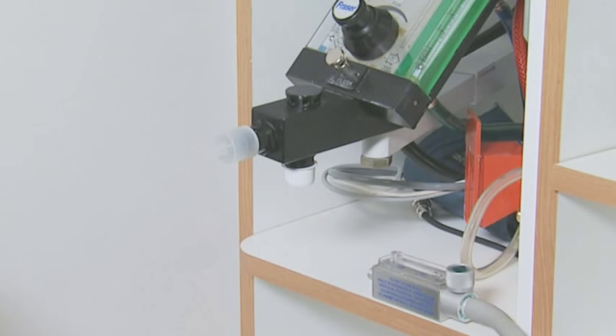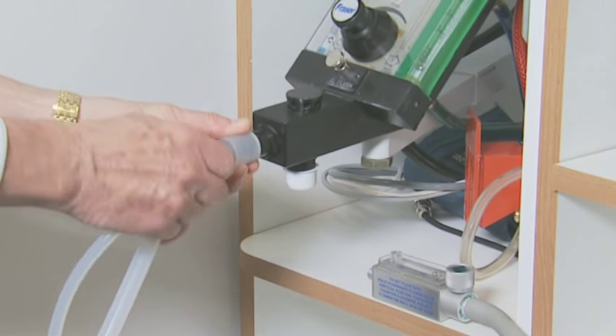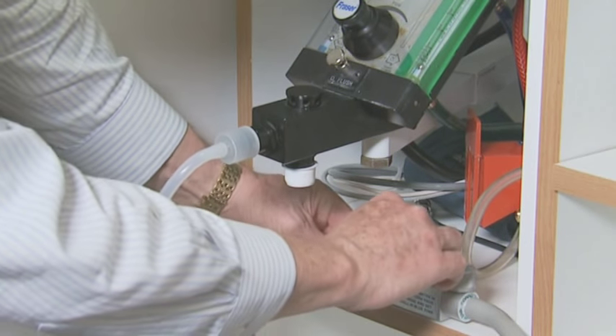We're now ready to attach the Silhouette Tubings, the smaller diameter for the fresh gas, and the vacuum tubing onto the vacuum block.